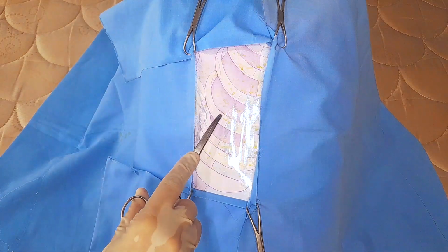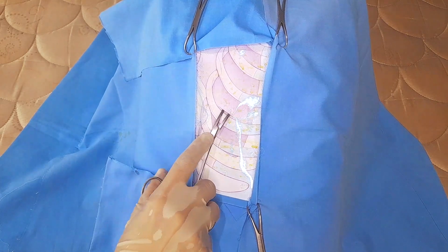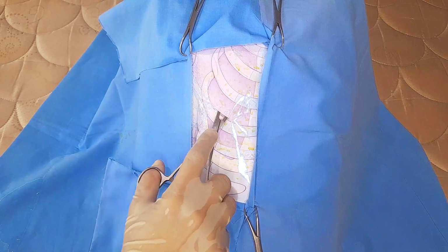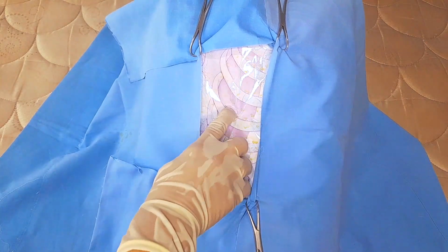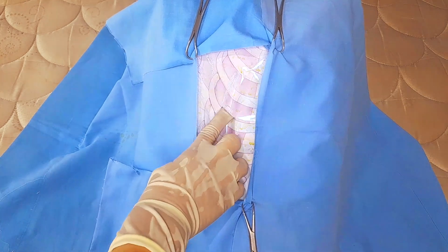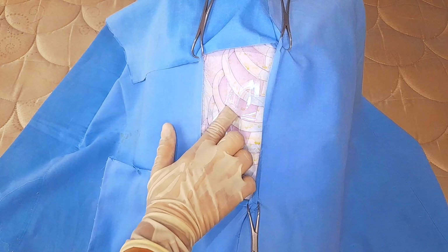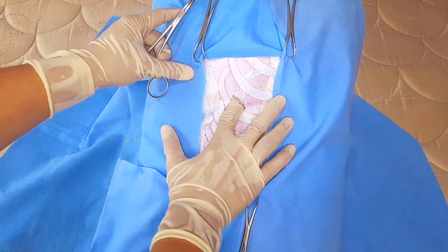Use Kelly forceps to separate the subcutaneous tissues. Use your gloved hand and Kelly forceps alternately to create a tract running posterior, superior, and medial into the paravertebral gutter.